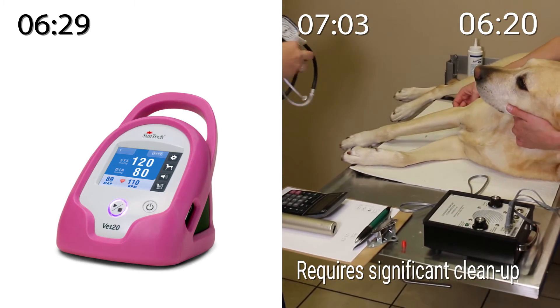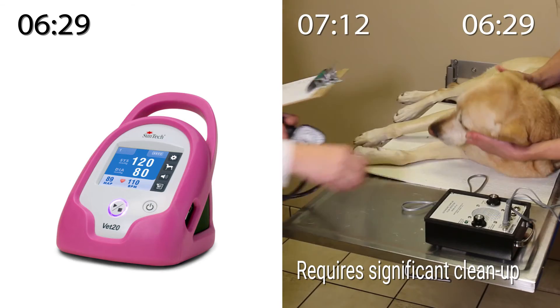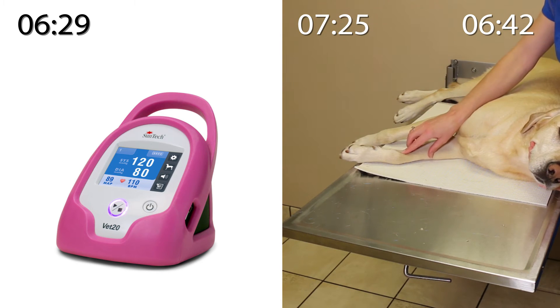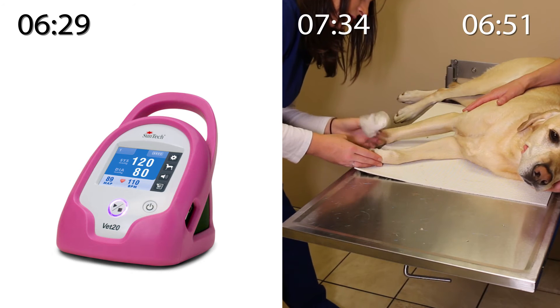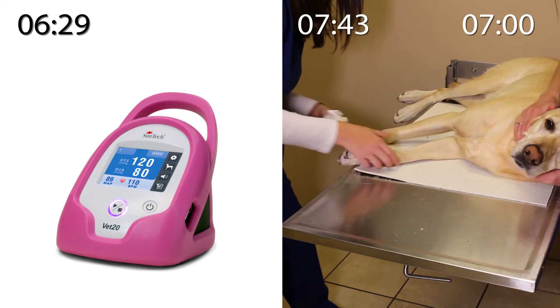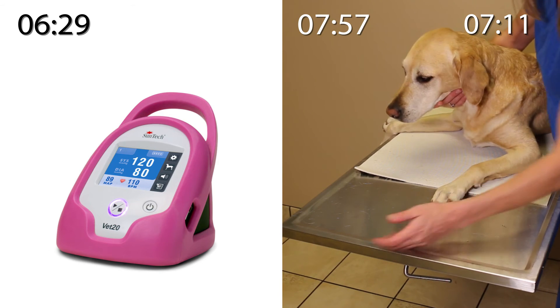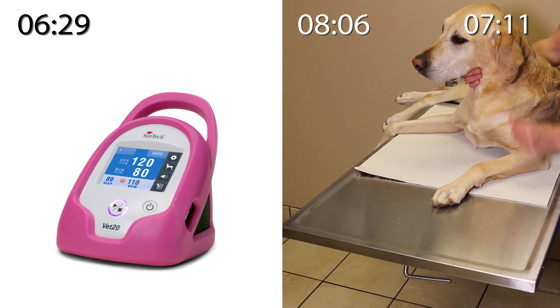Now the technicians will clean up the exam room and put away all the equipment used with the Doppler, while Tucker waits patiently. Before calling Tucker's dad back into the room, the technician cleans the gel off of Tucker's limb with a cloth. Now that they are done taking the blood pressure measurements, Tucker's dad is called back into the room.